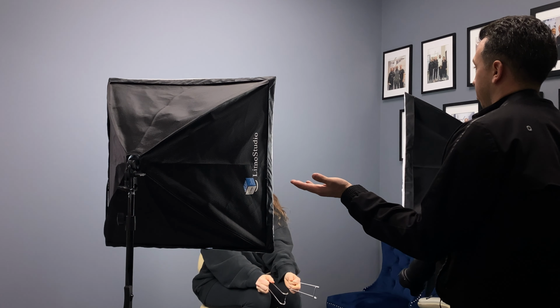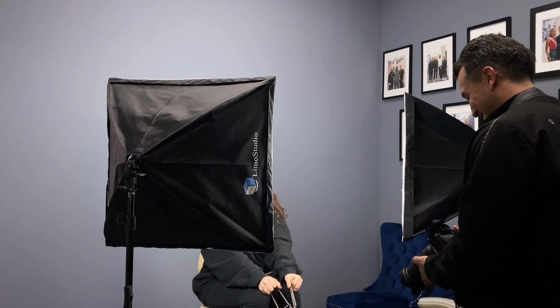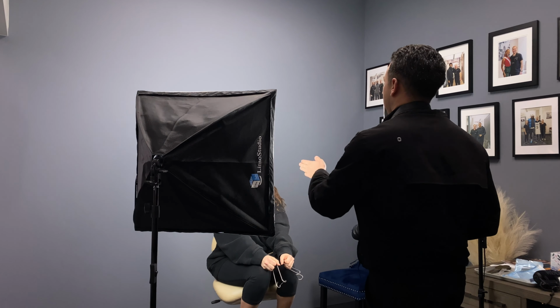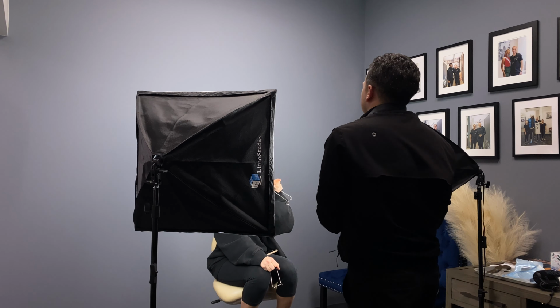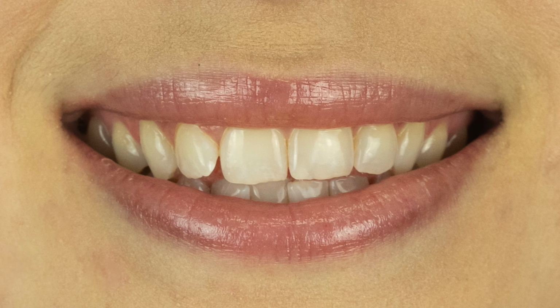All right, so this was today. I took some professional photographs, so I take basically two different types of sequences of photographs, like I did in my previous video. I think I did one just for basic diagnostic records, or maybe it was for Invisalign, but here I'm doing what I call, I nicknamed it Glamour Shots.